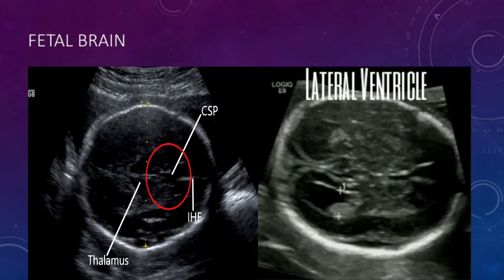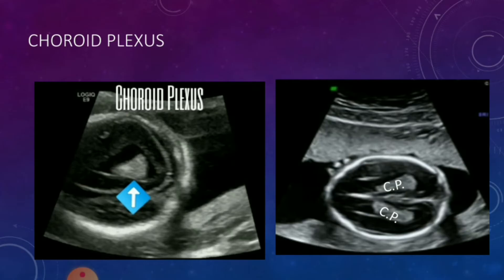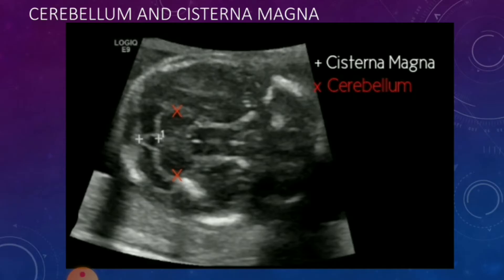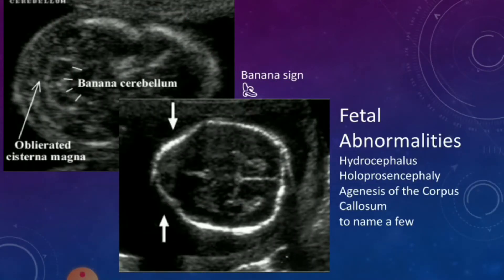Next, you want to look at the intracranial anatomy or the brain tissue. You want to look at the cavum septum pellucidum, the lateral ventricles — measured from inner to inner — the choroid plexus, corpus callosum, cerebellum, and cisterna magna. Looking at the intracranial anatomy, you can rule out things like hydrocephalus, agenesis of the corpus callosum, holoprosencephaly, cerebellar issues, Dandy-Walker malformations. You can see the banana sign, which along with the lemon sign can be indicative of spina bifida. Also schizencephaly, among many other things.